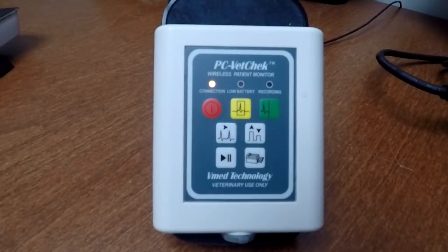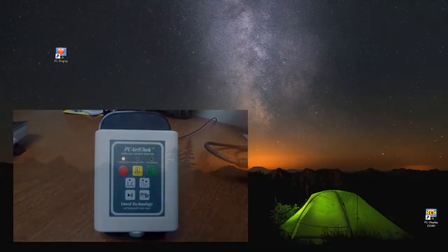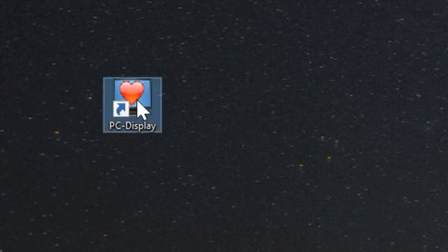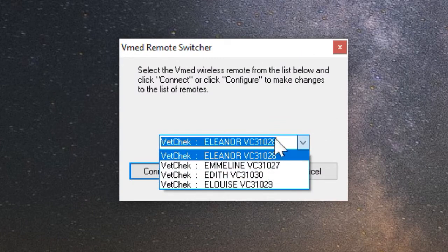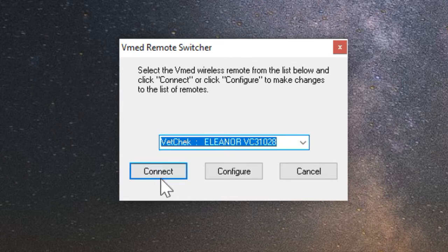Now that your patient is ready, we'll show you how to attach your devices to the computer system on the floor. Your PC VetCheck should have a solid red light indicating it's waiting for connection. Go to your PC Display on your computer screen and double-click on PC Display. It will give you a screen asking which remote device you want to attach to — all four names are listed, along with the three names of the older devices. Choose any device; in this case we are going to choose Eleanor, then hit Connect.